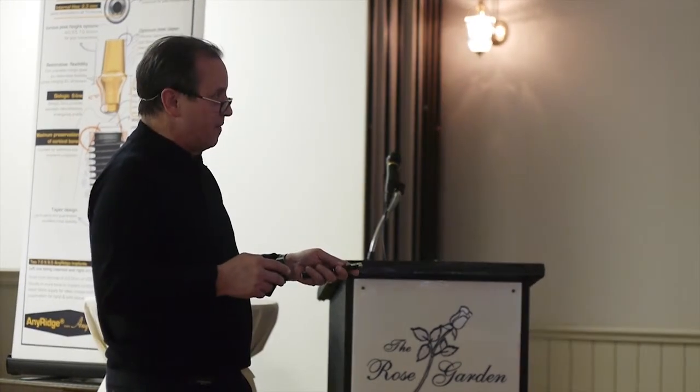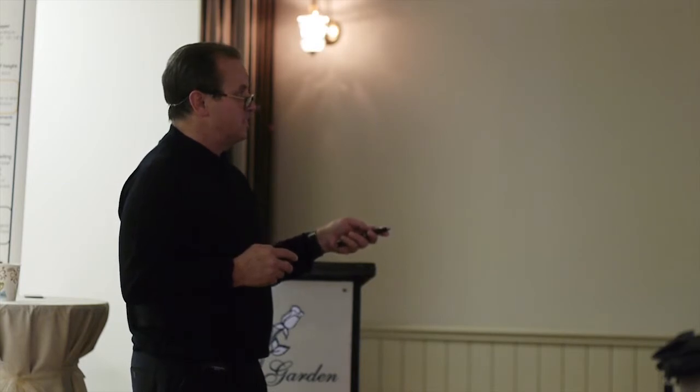This is a case that Malone and I did together. This lady had an upper denture. She's got this fixed bridgework on the bottom, which we wound up sectioning these pontics out and placing implants later. But the main thing was she wanted to get out of a removable prosthesis. So we do her scan, and you can see we've got a duplicate of her denture made with 10% barium sulfate and 90% acrylic, so we can take our scan and see where we lie.